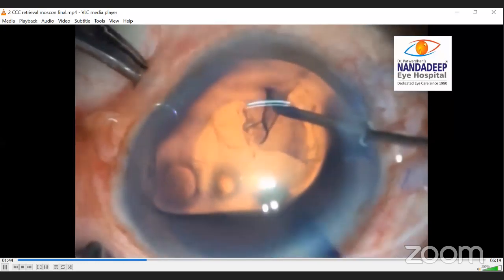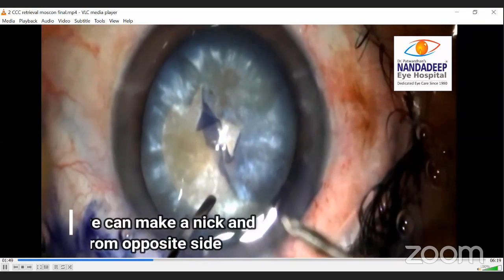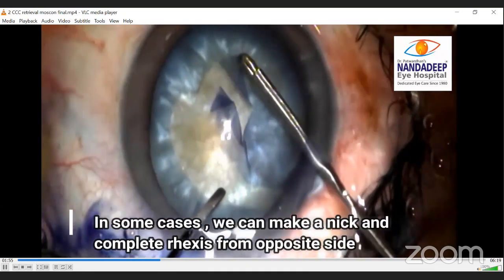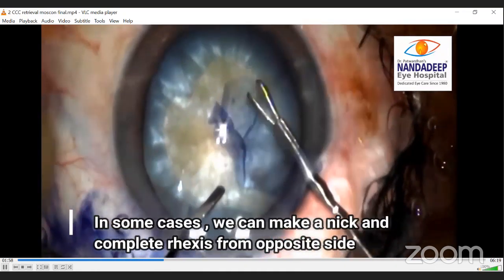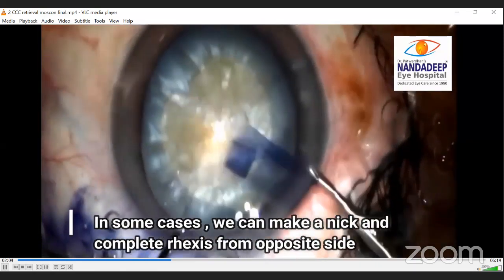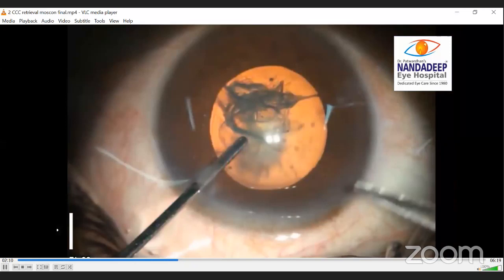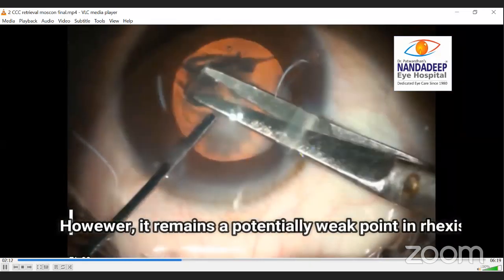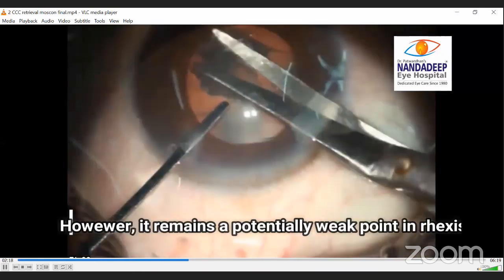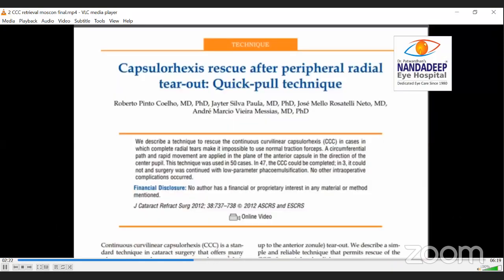It was described by Dr. Nito and his colleague. I will show the paper also. And there are other techniques that many surgeons use, where they just leave the extended rhexis and then they complete the rhexis from the other side. But then this CCC is incomplete and there is always a chance of complication. You may use either Vannas to cut the rhexis flap, or as I showed previously, you can make a nick at the edge of the CCC and make another rhexis from the other side. But again, it is an incomplete rhexis.